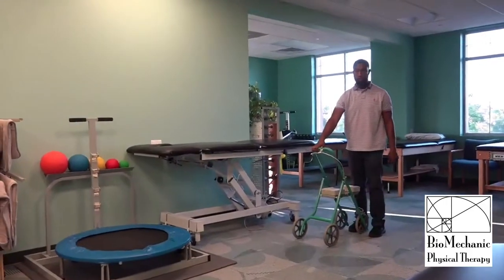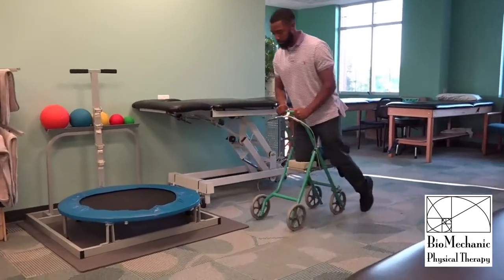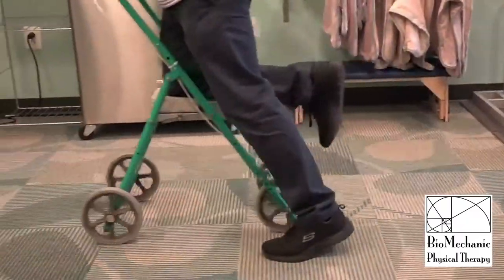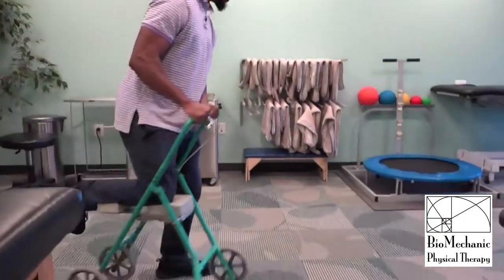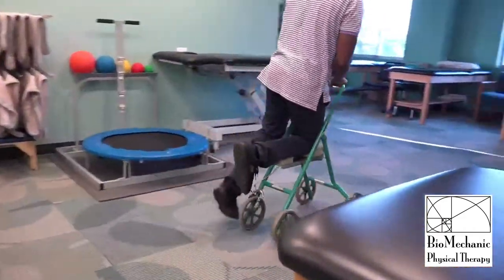Now Dion's going to try the Rollabout. Dion is looking pretty good on the Rollabout. In case you didn't hear that, he said this is so much easier.